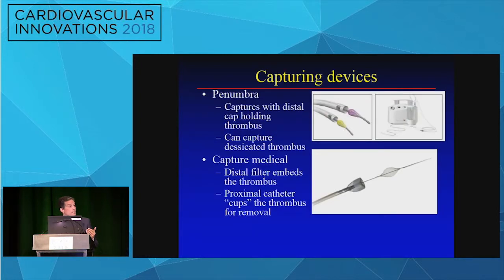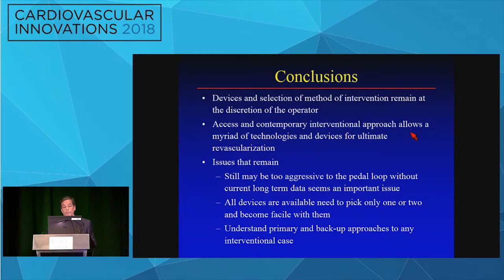But there are various competitors which work very well, one of which is the Penumbra device, basically a big tube that goes to a suction vacuum, and you basically agitate the hell out of the thrombus, break it up and aspirate it into a big tank right there, and it works. It works very nicely, even in subacute thrombus.